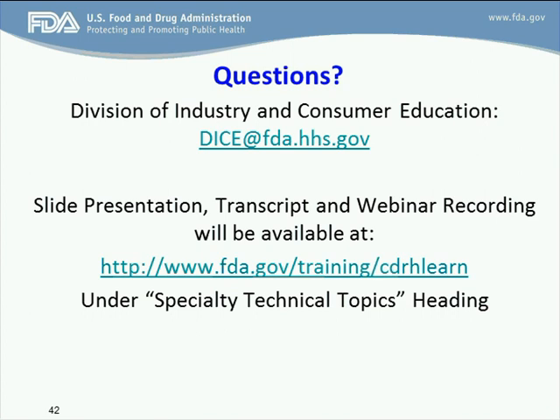This is Elaine Mayhall. I think in general we wouldn't expect you to do disassembly beyond the normal disassembly that the user would be doing for the device. So we wouldn't expect destructive testing unless there may be a situation where you have to demonstrate that liquids are not getting through or past those mated surfaces and into other areas. But in general, we wouldn't expect you to do destructive testing.